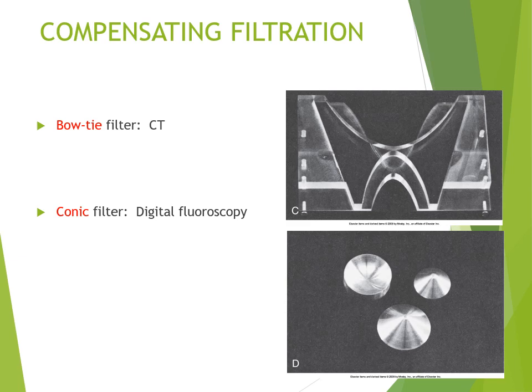And then we have a bow tie filter, which is used in CT, and we have a conic filter used in digital fluoroscopy.